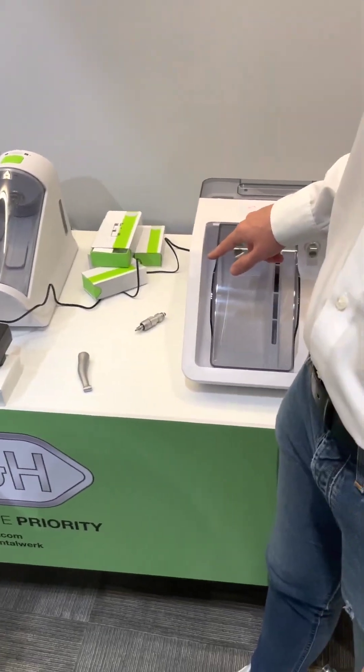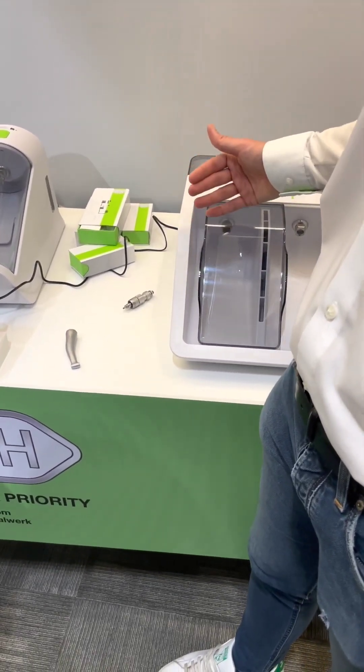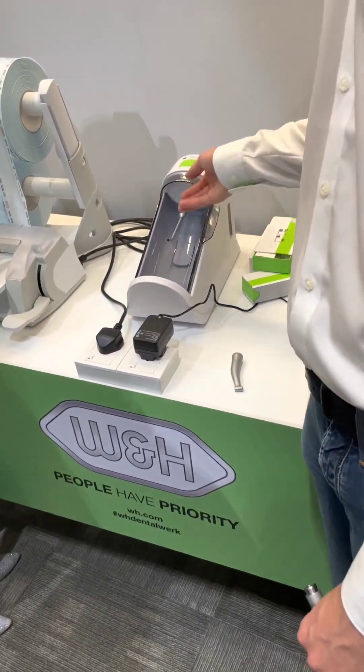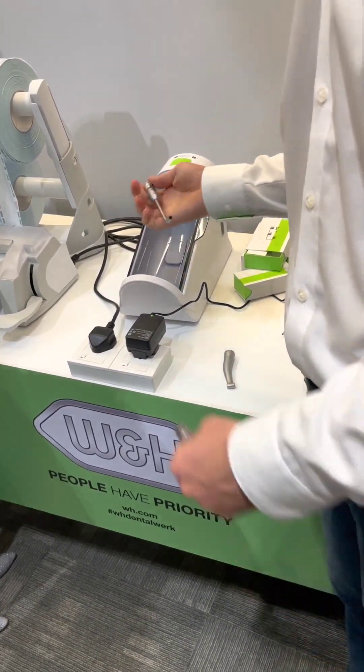With the Assist in a Twin, if the door is open, the cycle doesn't start. But here, since there is no electricity, you have to pay attention to close the device properly.